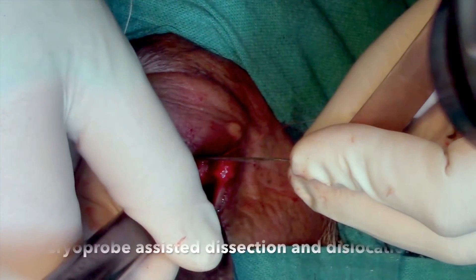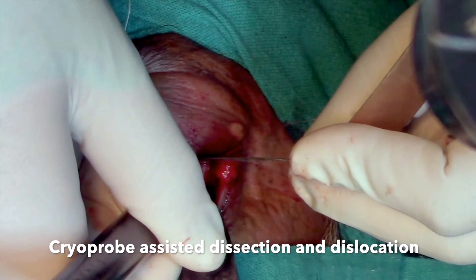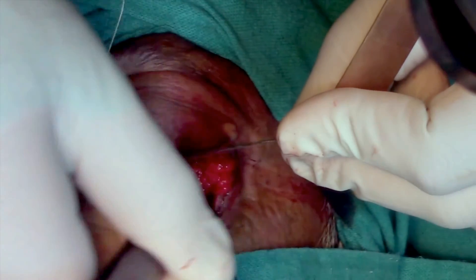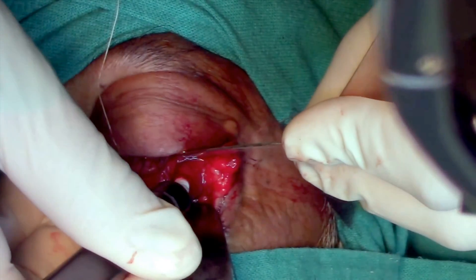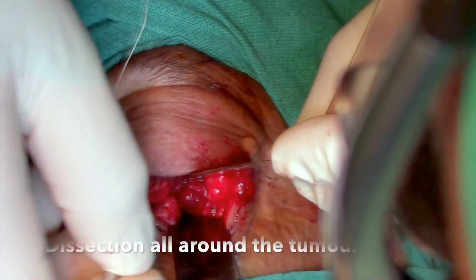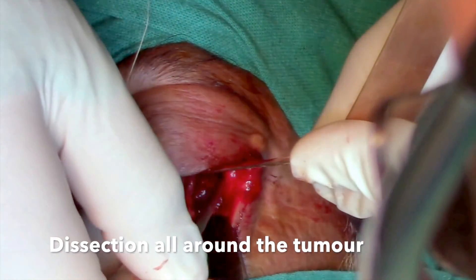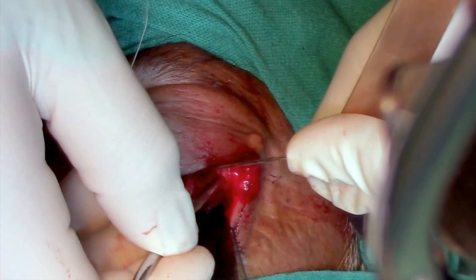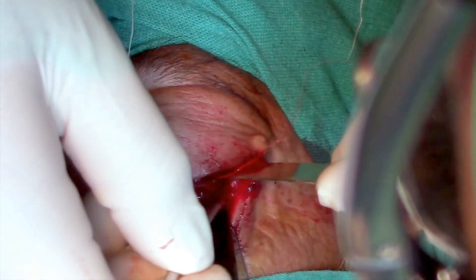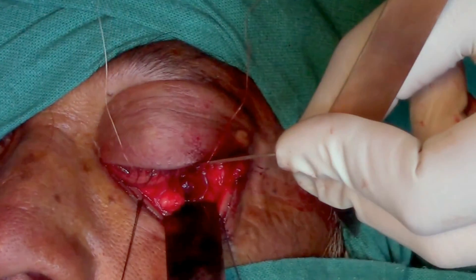Once you have dissected all around, use a cryoprobe to lift the tumor. In this case, sideways manipulation dislocates any attachments the tumor may have. Here, the tumor doesn't come out as easily as one would expect cavernous hemangiomas to, suggesting that there are some attachments still present around the tumor. I am now using a suction cannula to dissect further and remove any remaining attachments around the tumor.